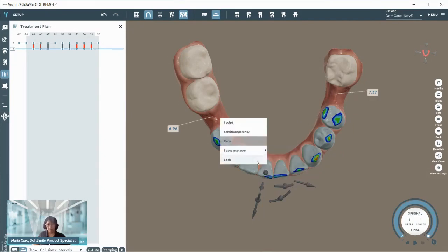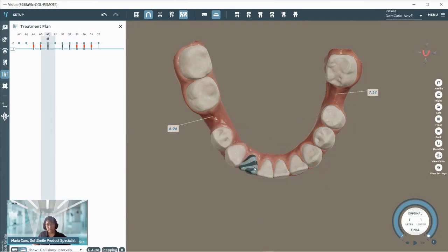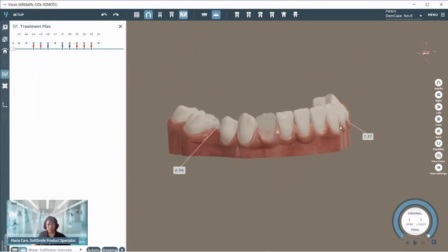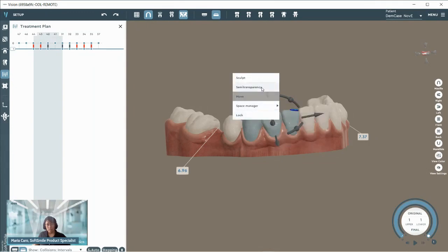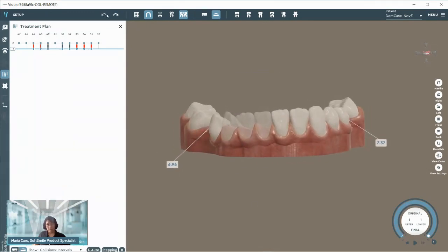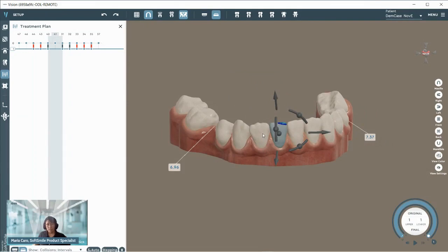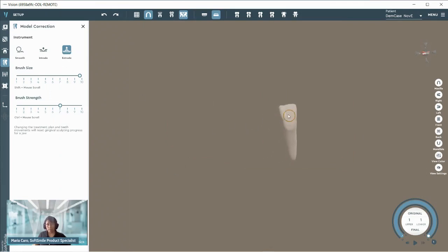Other tools include the lock option — select a specific tooth, right-click and lock it so it doesn't move within the treatment plan. We also have semi-transparency, which allows us to see either a group of teeth or an individual tooth made transparent. We can also select a specific tooth and sculpt it — smooth, intrude, or extrude the surface of the tooth while managing the treatment plan.